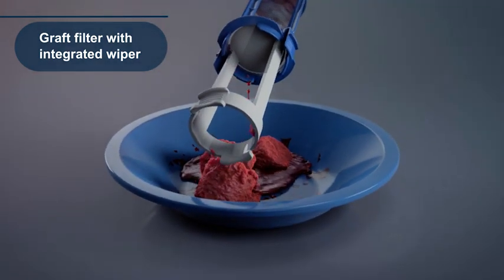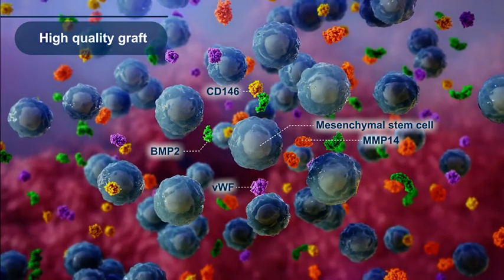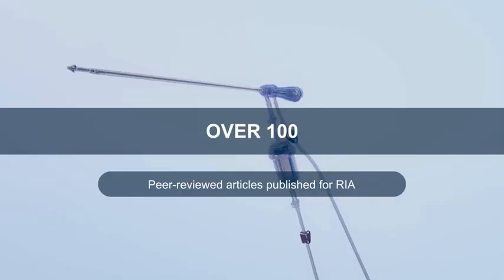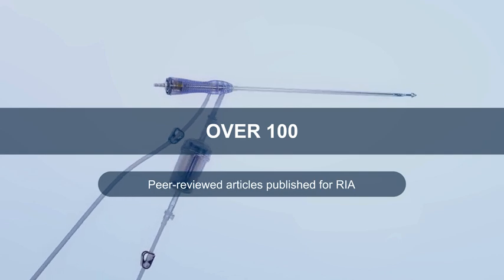Grafts are of higher quality, with a greater enrichment in mesenchymal stem cells and growth factors such as BMP2, which support osteogenesis and angiogenesis. This technology has been in use for over a decade, with over 100 published peer-reviewed articles.